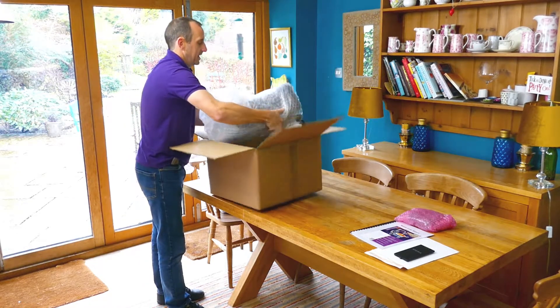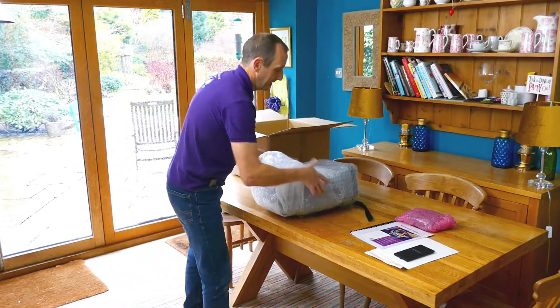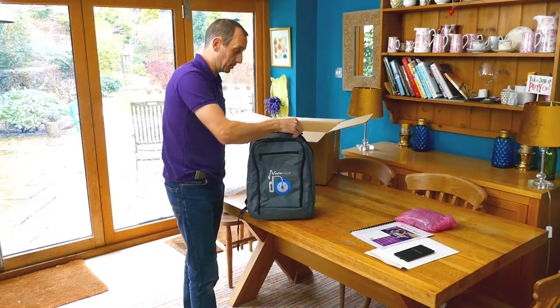Further in the box you'll find the robot. Inside the packaging it is in its bag. This is the same bag you can use to transport the robot in.